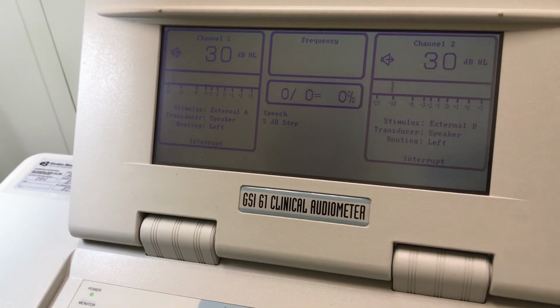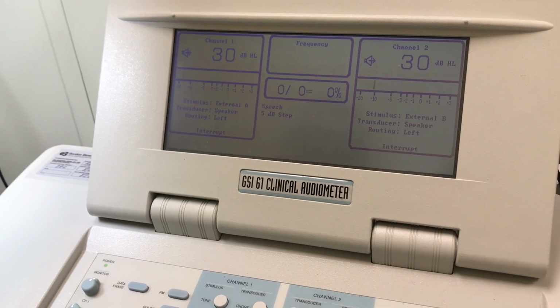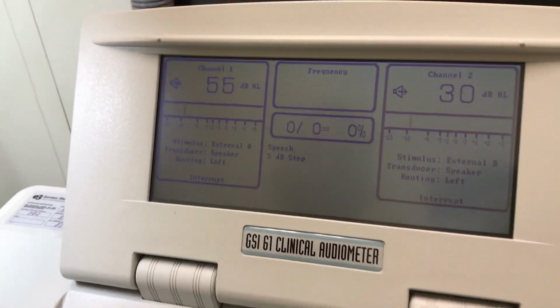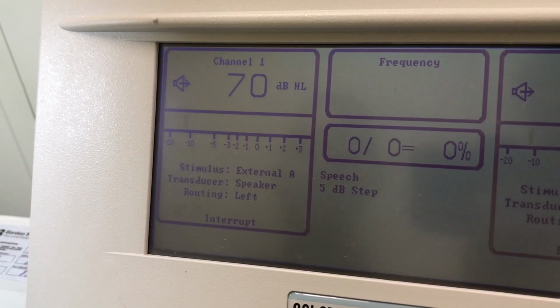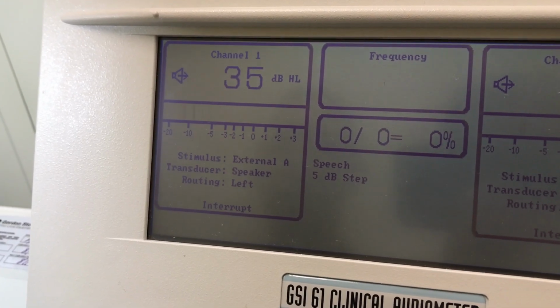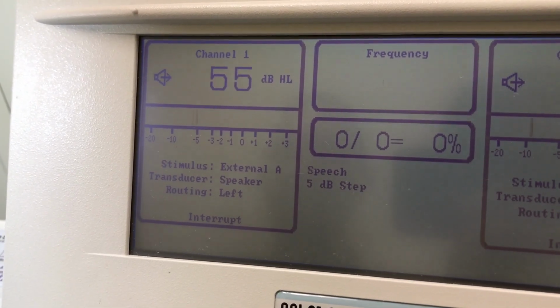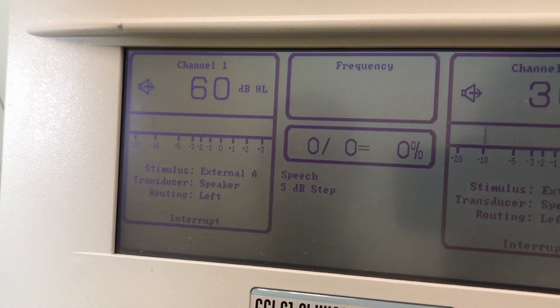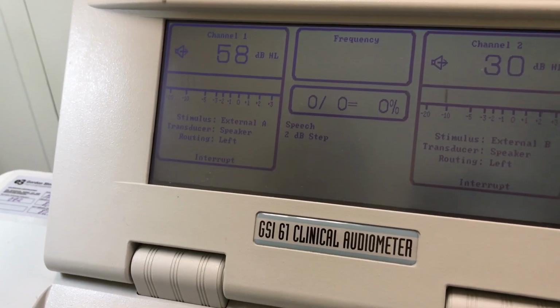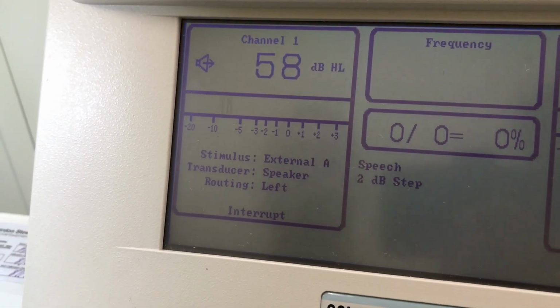So once we know we've got the equipment set up appropriately, we're going to measure the most comfortable listening level. We start at 30 dB HL. We increase in 5 dB steps until the patient indicates that the signal is getting a little bit too loud for them. We drop down in 5 dB steps until the patient indicates that it's beginning to get too soft. We stay in 5 dB steps until we get close to their most comfortable listening level. When they reach a level that they consider to be close to the most comfortable, we can change our step size to 2 dB or 1 dB based off of the audiometer. And so once they've indicated what is the most comfortable listening level, we go to the background noise level measurement.